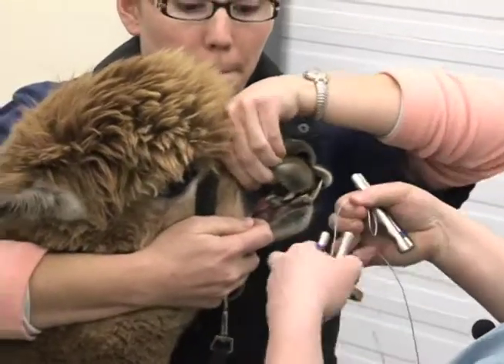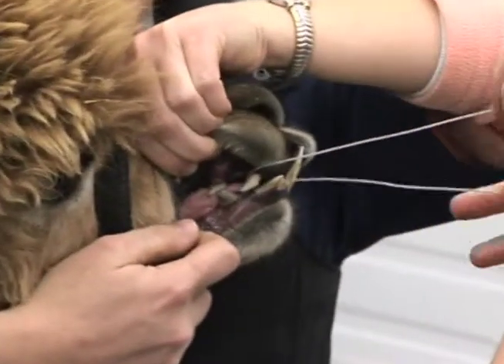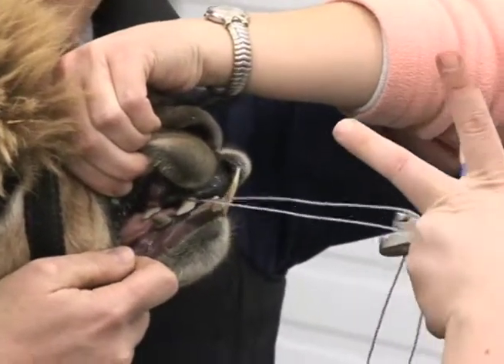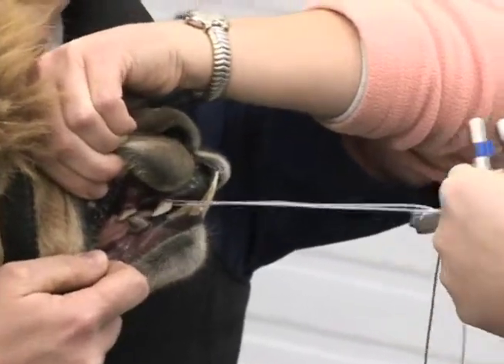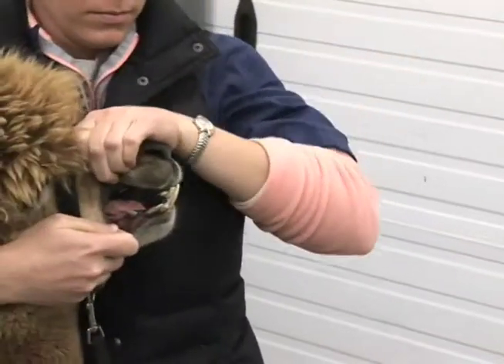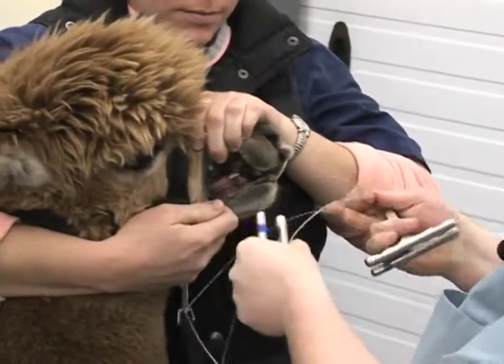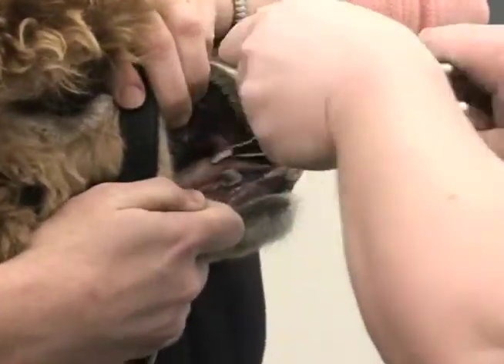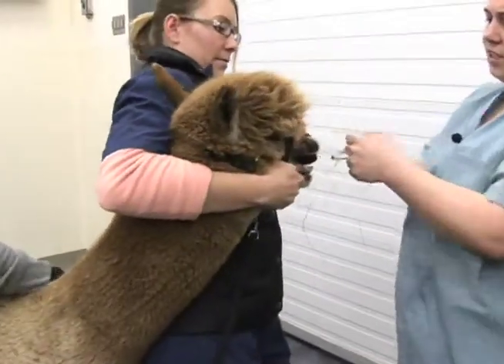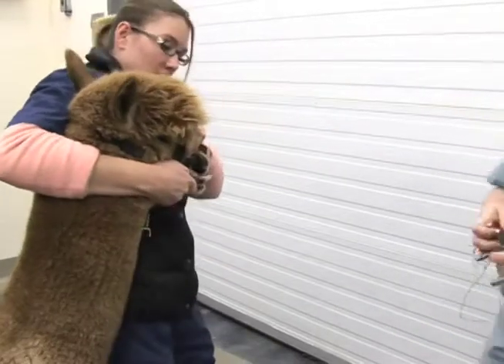Now that we have our teeth exposed, what we're going to do is place our wire back behind the hook of this tooth. Keeping a little bit of tension just to hold it in place, we're going to go as close to the gum line as possible. Then we're going to use steady, even pressure back and forth, and eventually the tooth will just kind of pop out. Then at that point you can move on to the next tooth. Again, slip it back behind the curve of it close to the gum line and provide even pressure using long even strokes, and eventually that tooth also will pop.